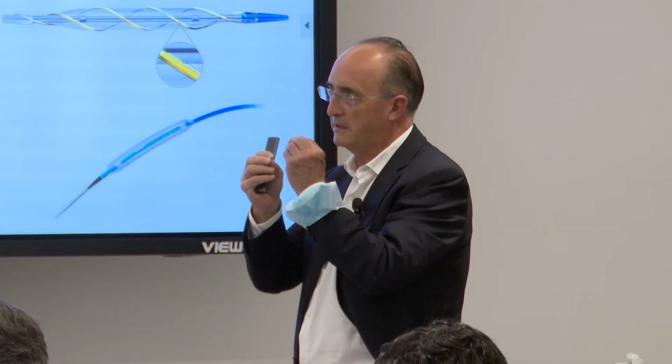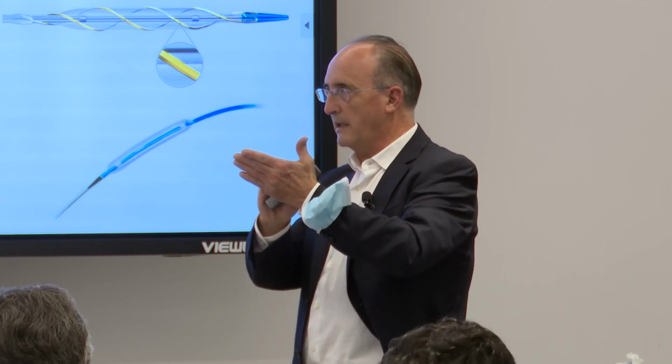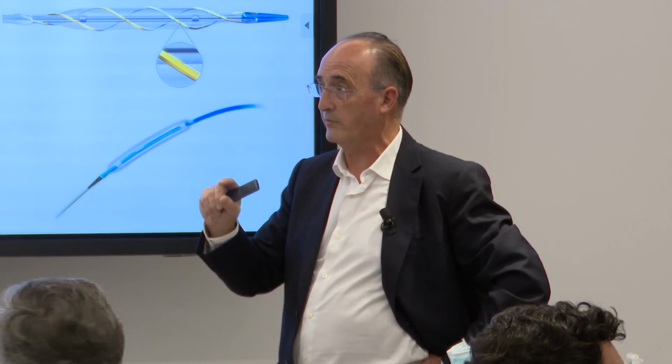We have to have the evidence, because in theory, you can say, well, everything is great, we break the calcium, we munch it up in little pieces and everything goes away. But I fear that that is not very often the case. I think that it will act as a lever also to the other side. So that is why I ask you if in those cases, if you do not have intracoronary imaging, and I think you put it in your protocols, undersize by 0.5 the high pressure balloons.